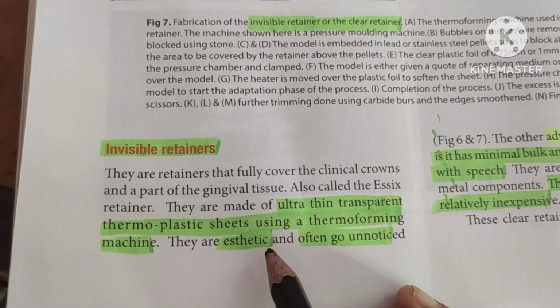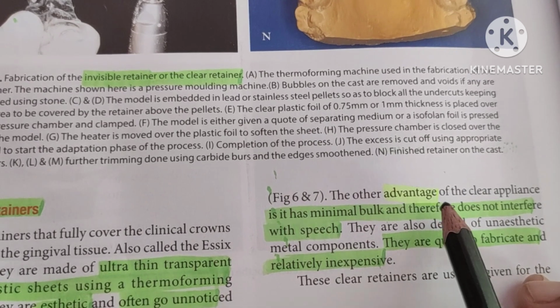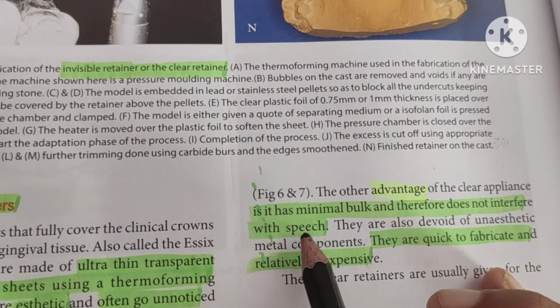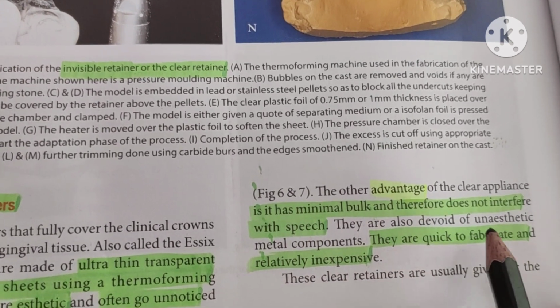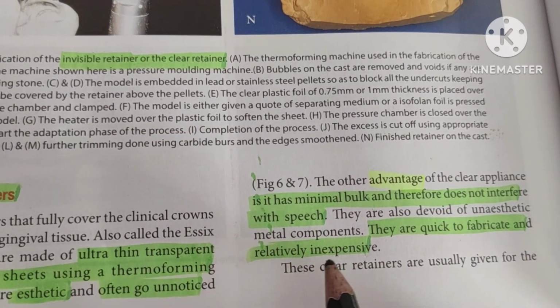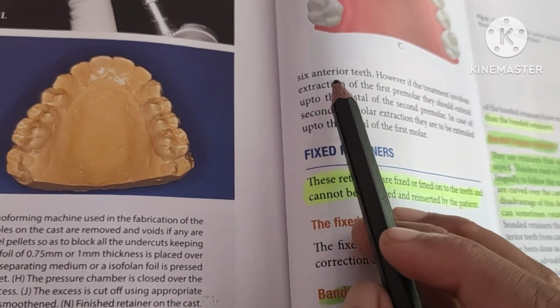They are aesthetic and often go unnoticed. The advantage is it has minimal bulk and therefore does not interfere with speech. They are also devoid of unaesthetic metal components. They are quick to fabricate and relatively inexpensive. The clear retainers are usually given for the 6 anterior teeth.